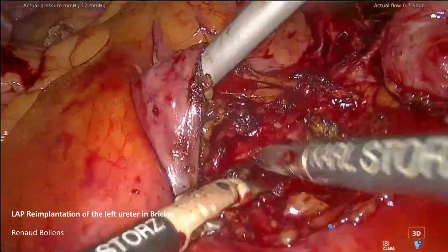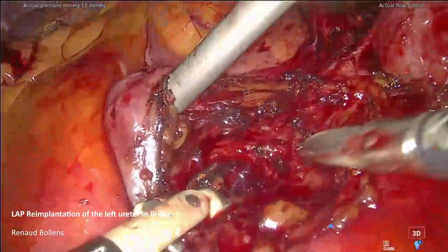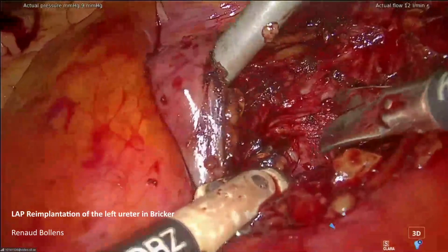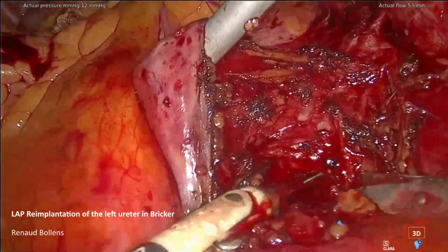Yeah, because it is interesting. We are sort of moving into an era where pressures are becoming important. Can you aspirate here down? Alex Mottis is using a pressure of 5. So it is a bit contradictory in that sense that your only defense other than good technique is... I believed that it was far away from the vessel, but it's not true.